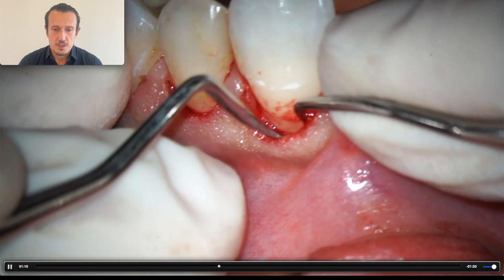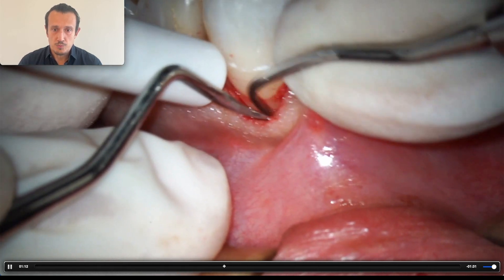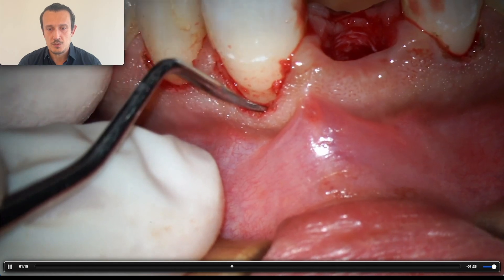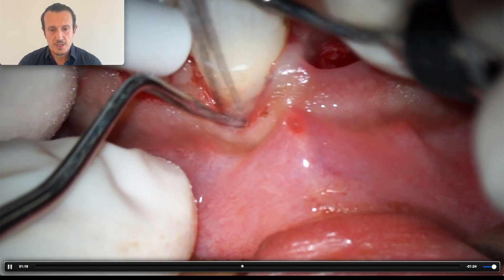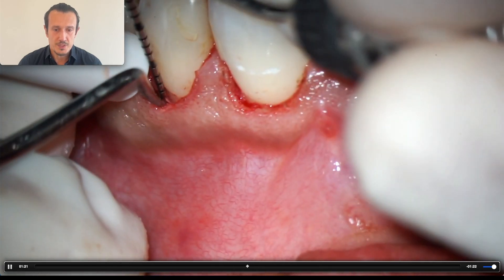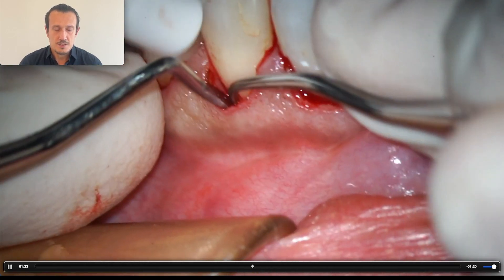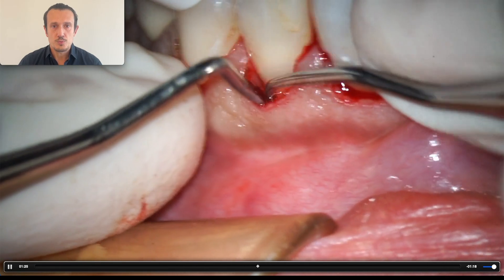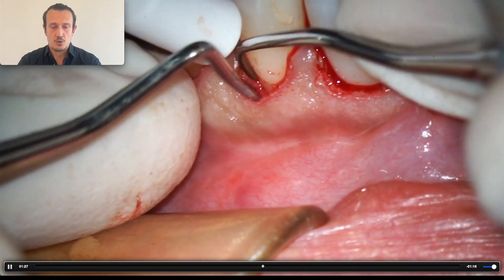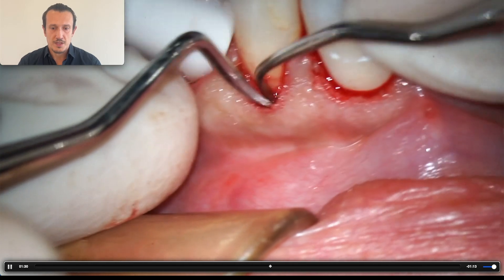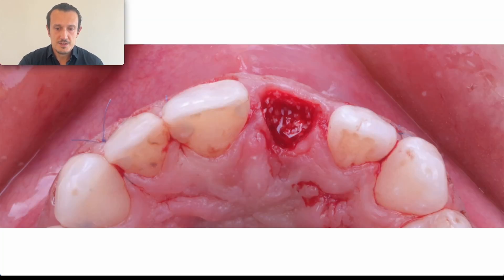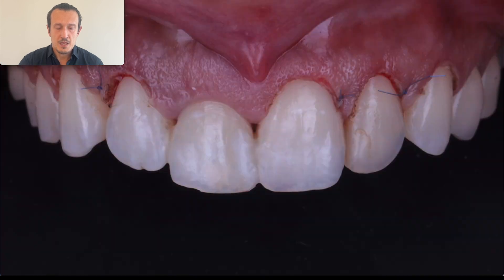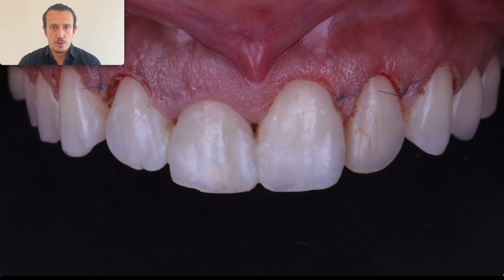You need to put some pressure with the curette and at the same time be gentle to the soft tissue. With the piezoelectric instruments it's now easier to accomplish. It's the same on the lateral, and you need to perform the same procedure on the canine and on the canine and lateral on the other side.